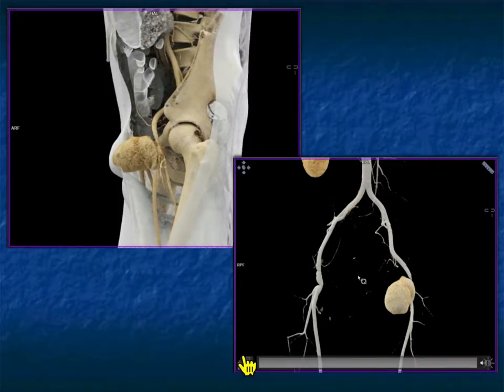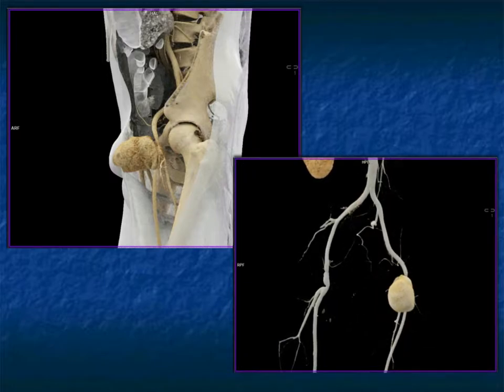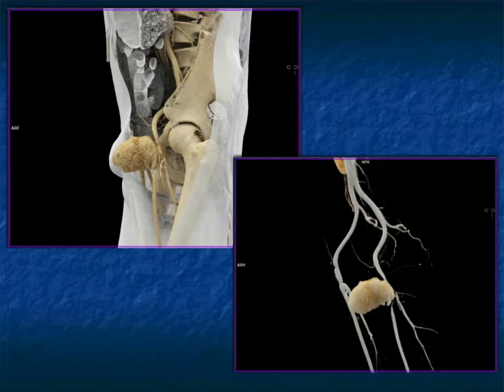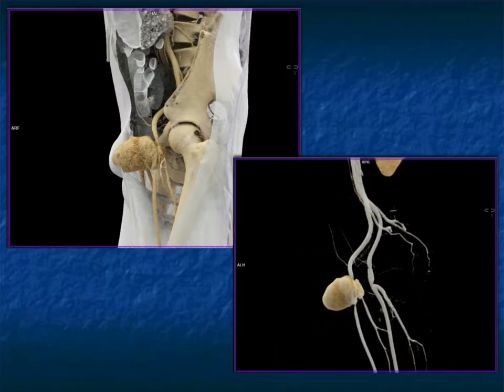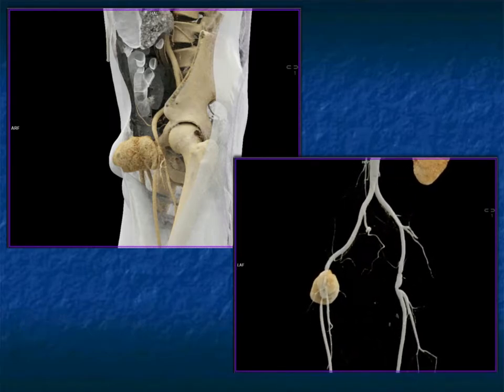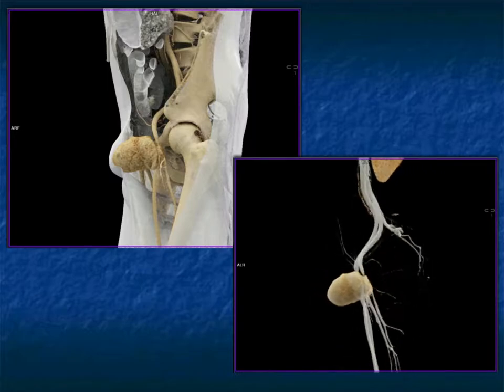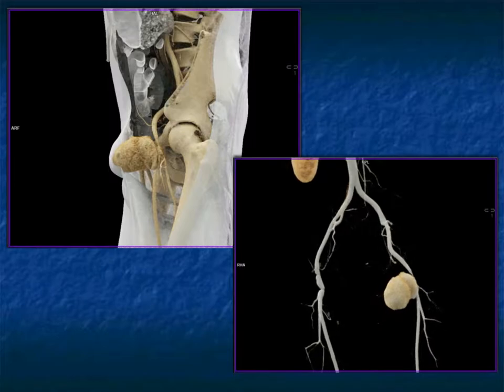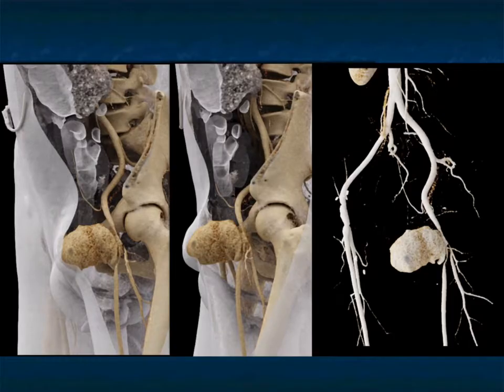In the bottom image I've taken away everything — only left the native vessels and pseudoaneurysm. A good way of analyzing: the aneurysm or pseudoaneurysm is seen on the axial images, that's easy, but understanding the extent and planning how to operate or embolize becomes very critical from these 3D maps. So it's very exciting.